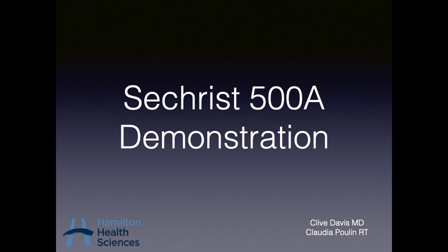This relatively short video was filmed inside the hyperbaric medicine department at the Hamilton General to demonstrate 3 primitive controls on the Sechrist 500A ventilator. The goal of this video is to explain basic setting features of a pneumatically controlled ventilator in an effort to support this new project partnership between Hamilton Health Sciences and Battlefield International.